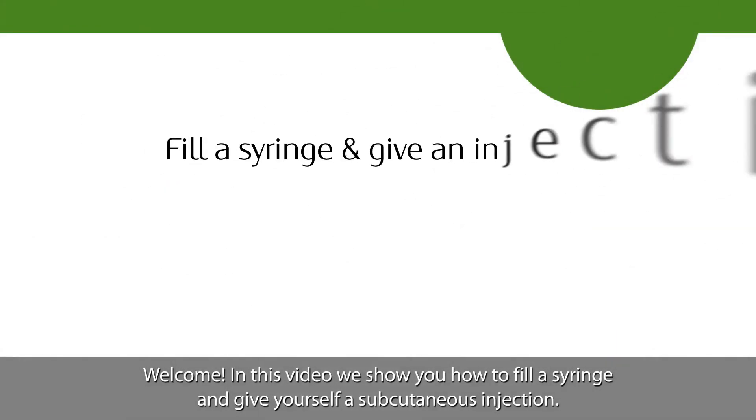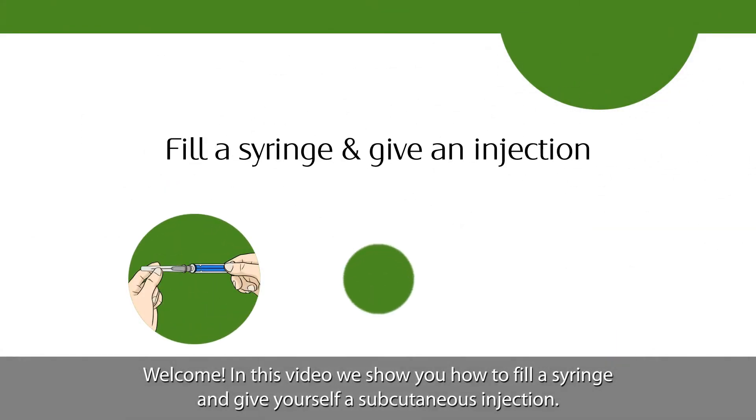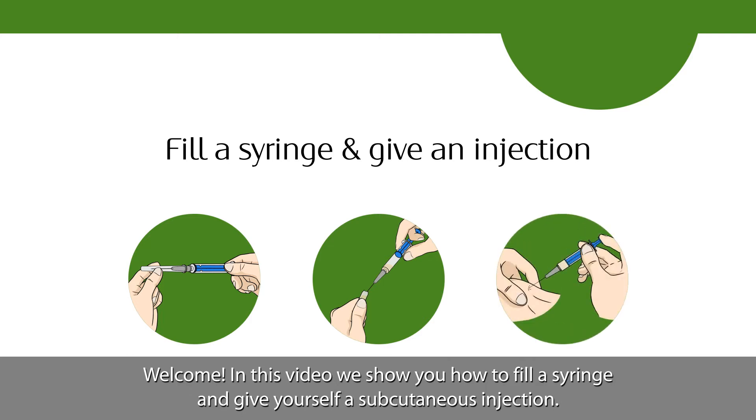Welcome! In this video we show you how to fill a syringe and give yourself a subcutaneous injection.